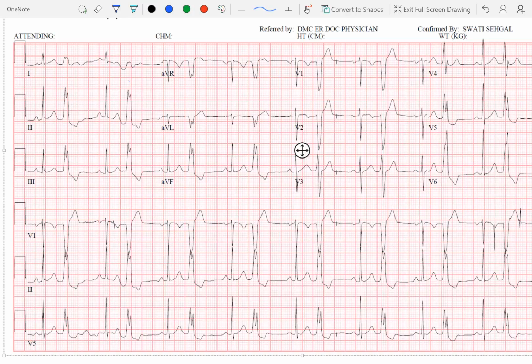So you mean in the right ventricle? No, if you have a PVC that is coming from the right ventricle, usually that is going away from the right ventricle because that's the site of origin. Okay. So then it would be negatively deflected. Yes, because lead V1 is looking at the right ventricle, and it's anterior as well as a rightward lead. So a PVC coming from the right ventricle would be going away from lead V1. Okay. That would produce a left bundle branch block morphology. Conversely, a PVC coming from the left ventricle is going to be the opposite. It's going to produce a right bundle branch like morphology.